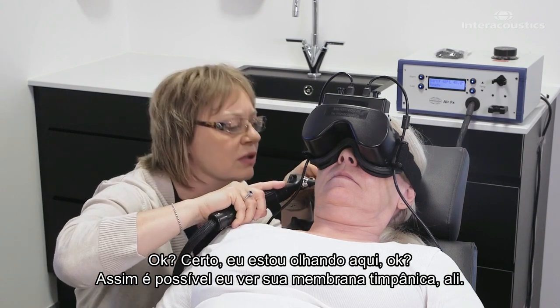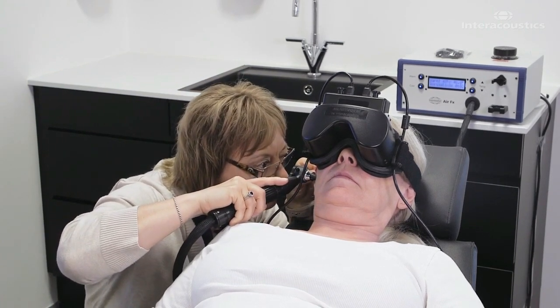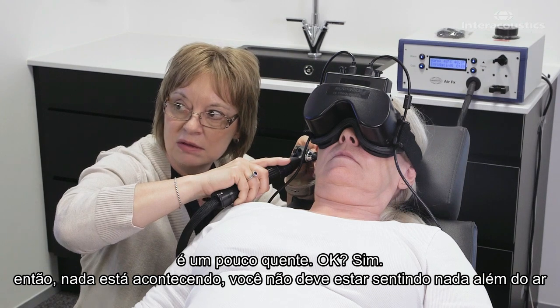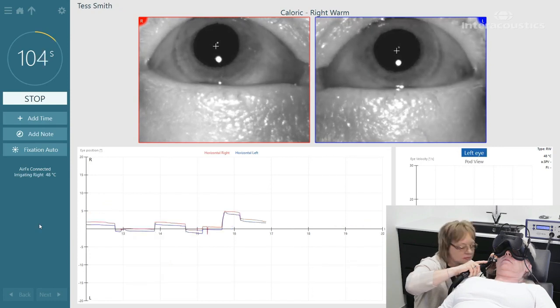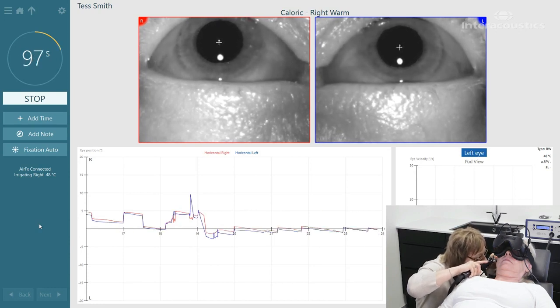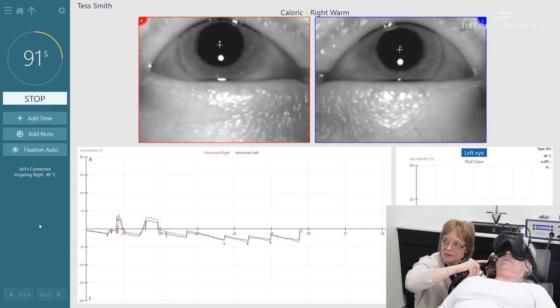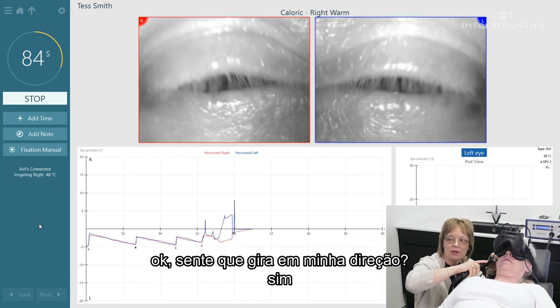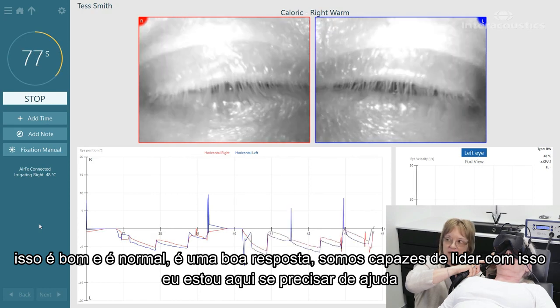As soon as I can see your eardrum right there, I'm going to go ahead and start the test now. I know it's a little warm. So nothing is happening yet — you shouldn't feel anything other than the air. Now you might start to feel like you're turning towards me a little bit. If you start to feel that, you can let me know. So you feel like you're turning towards me? That's a good, normal thing — that's a good response.